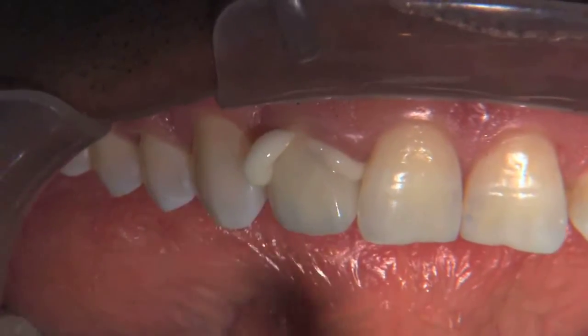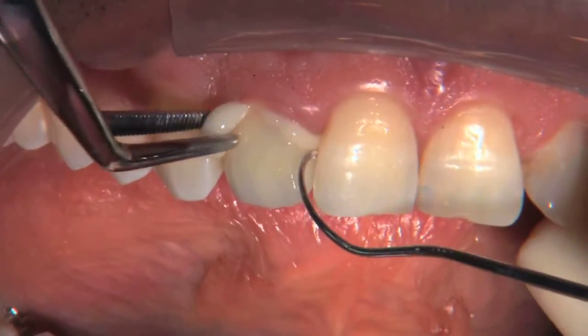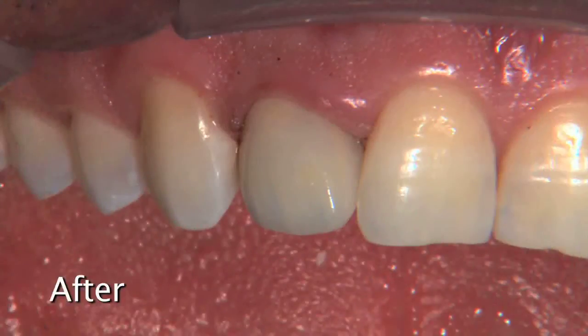The more IPS Emax lithium disilicate is used in everyday dentistry, the more it will be relied upon as an aesthetic and durable alternative to PFMs. Here in our laboratory, PFMs made up 65% of the crowns that we fabricated in 2007. Now in 2013, PFMs are only 19% of the crowns that we're going to fabricate this year.